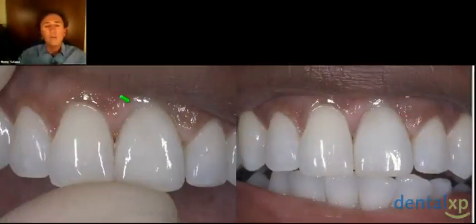It will blanch a little bit while we're waiting, but certainly we've been able to create a situation that, in as little as 10 weeks, has delivered a final restoration in a type 1 site in tissue.